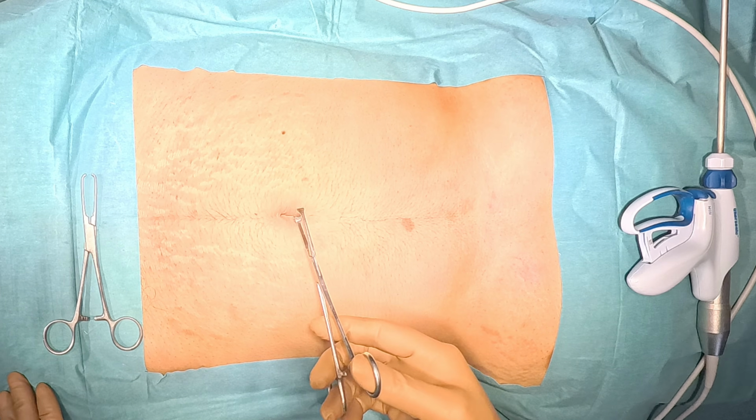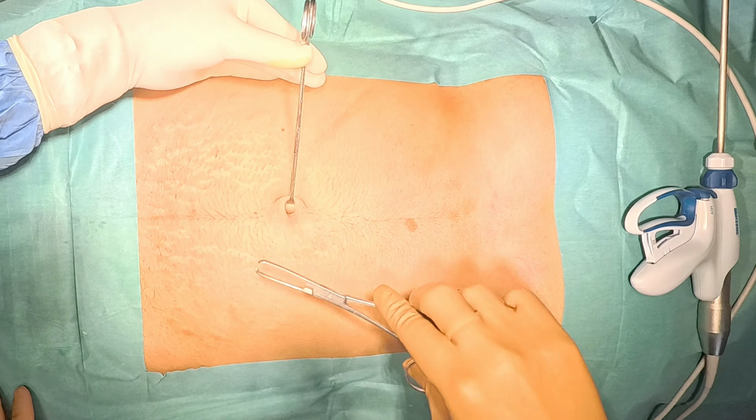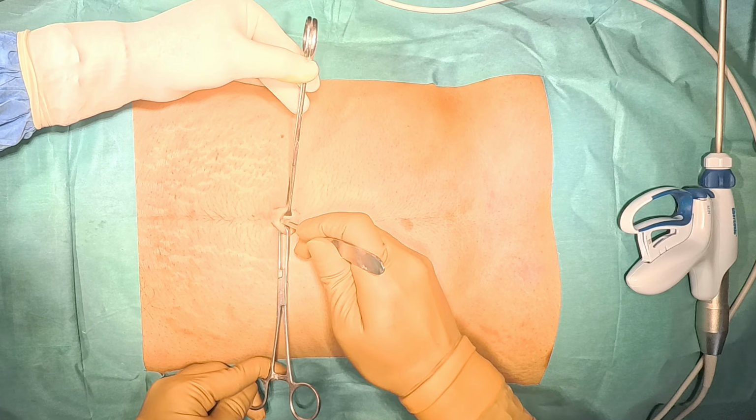Hello friends, this is a case of laparoscopic cholecystectomy and appendectomy. This patient has previous episodes of appendicitis and she also has multiple gallstones with previous episodes of cholecystitis.